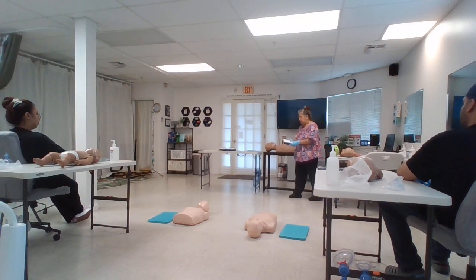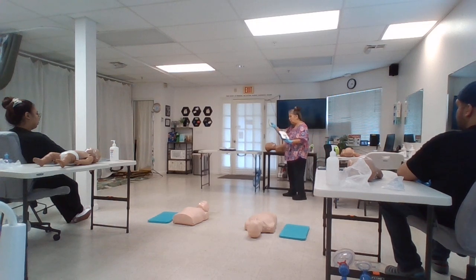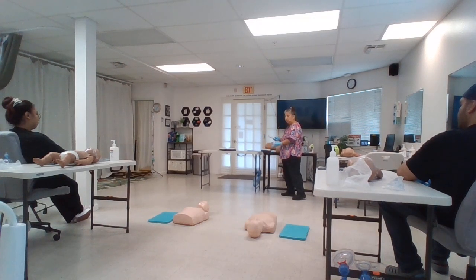Okay. So when you use this AED machine, you need to turn on the button, the green one. So that's the green button. And you always have to place it right next to the head of the adult or the infant. So I'll turn it on, and then I'll show you where to place the pads on. If the patient is a child, press the child button. So it's not a child.